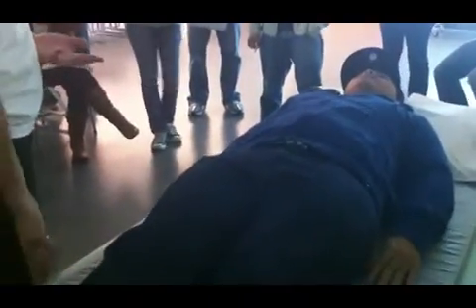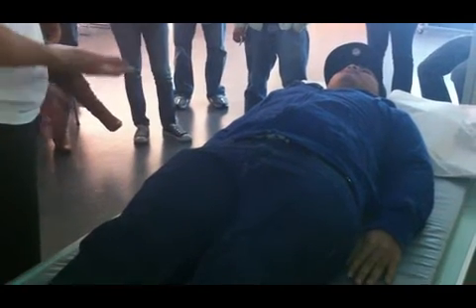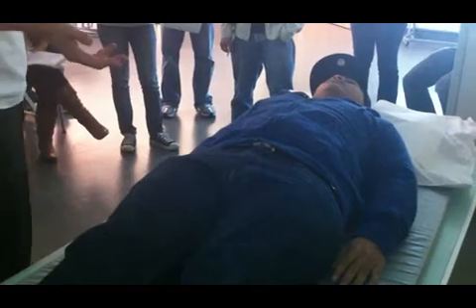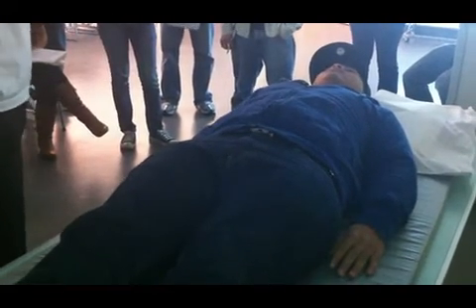There, come on in. Grab this, lie down on your back. Get over. You bring your table up, okay, or raise it up, whatever. That's going to adjust the size of your collimation as well. So if you want to move this up a little bit, you're going to have to move this up correlatingly to keep your collimation the same.